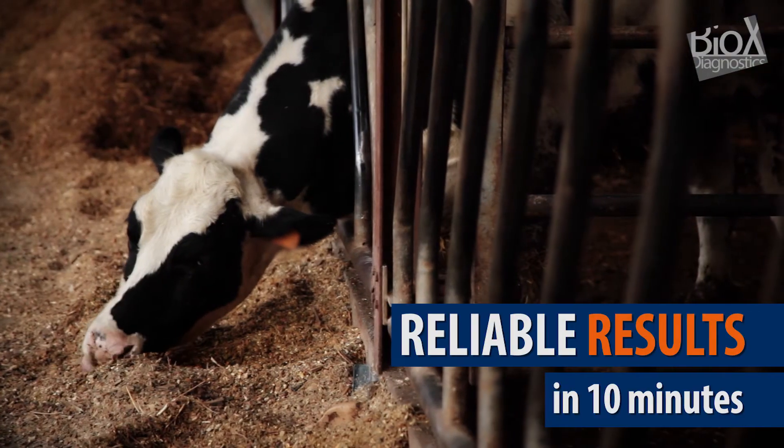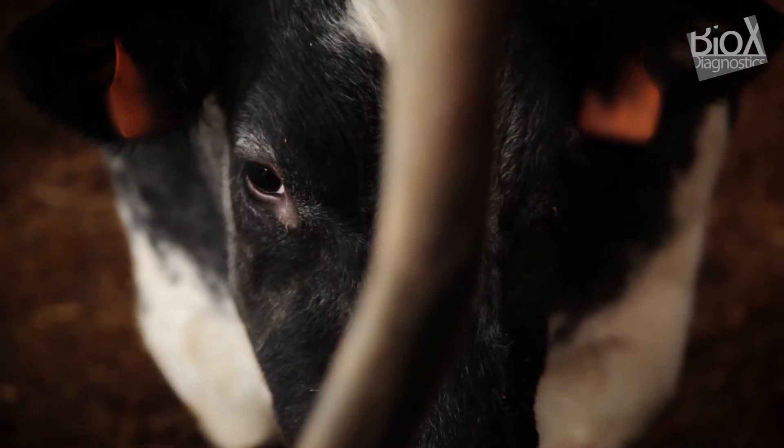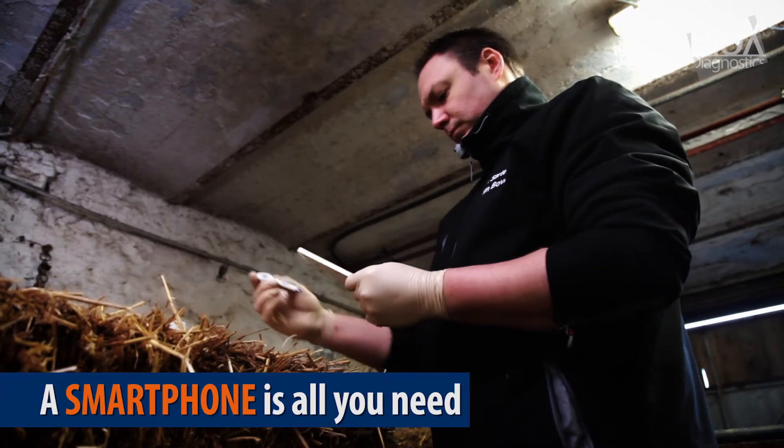While a laboratory test takes several days to bring you results, SmartStrips can perform the task in only 10 minutes. No need for costly or sophisticated equipment — you can read results with a smartphone.